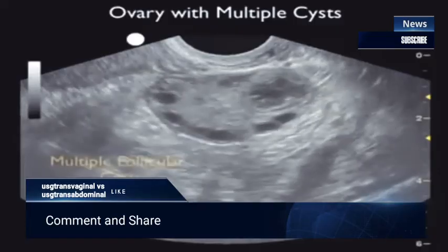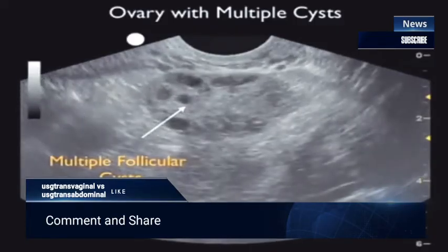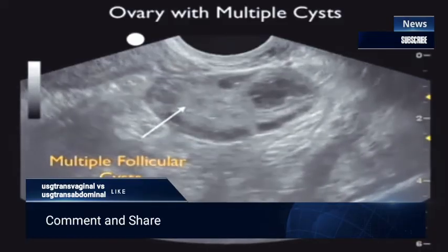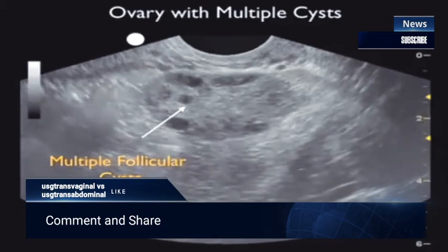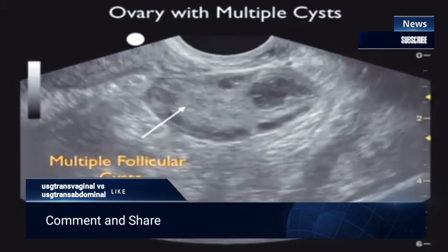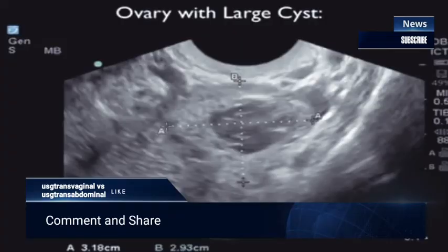Here's another ovary with multiple cysts. Again, we're scanning in a short axis configuration through the ovary, and notice the presence here of multiple small follicular cysts towards the outer periphery of the ovary. Now, to the rightward aspect of the ovary, we can see a larger cyst, which is consistent with a degenerating corpus luteum cyst.